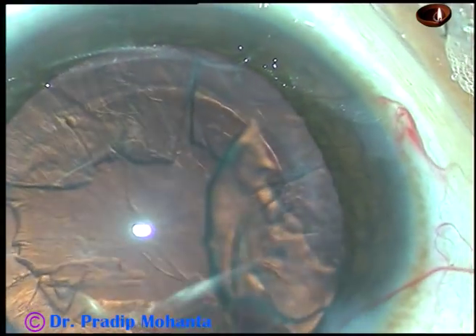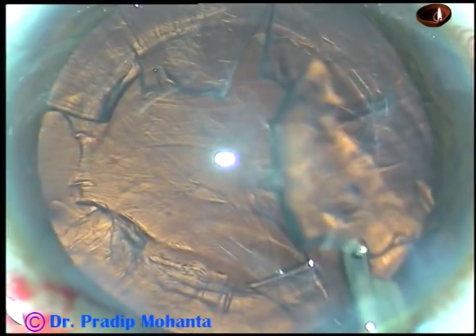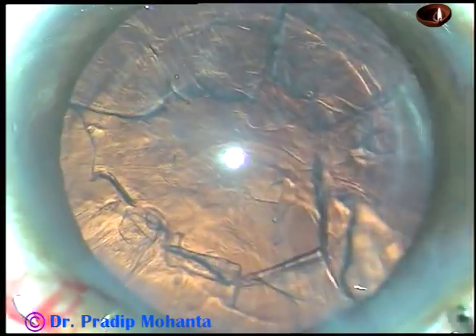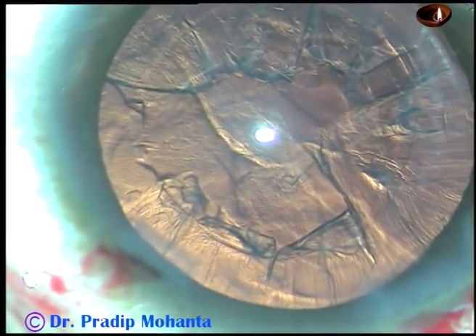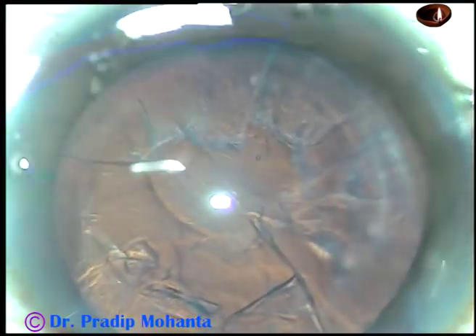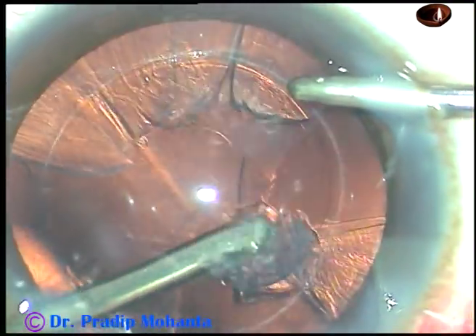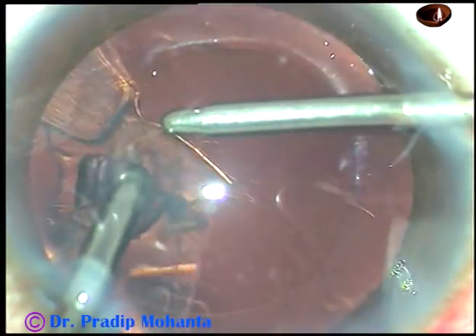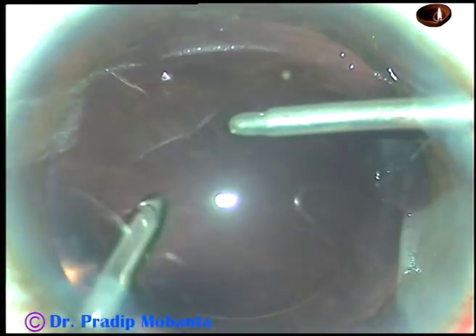Now, cortical cleanup is going to take longer time. Visco has been injected into the anterior chamber. This is a piece of epinucleus being guided and removed. Bimanual irrigation aspiration is being used to remove the cortical matter — irrigation from the right side and aspiration from the left. See how easily you can remove the cortex. The whole cortex is removed.